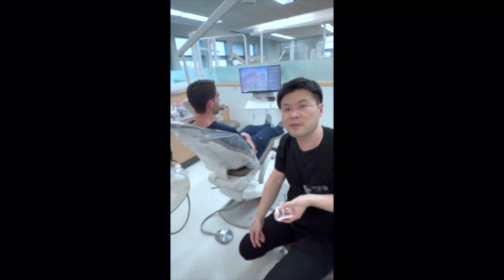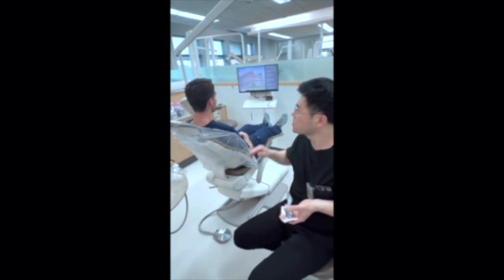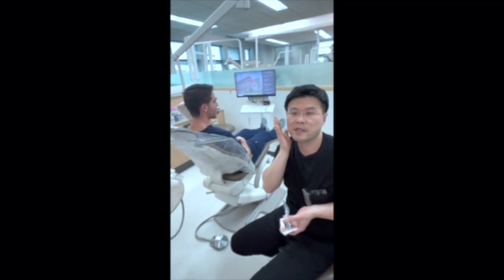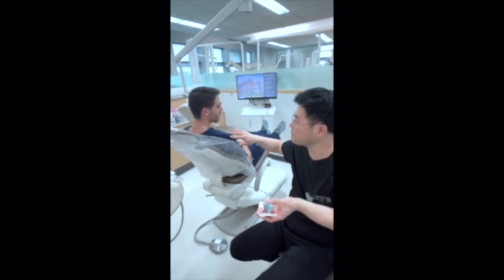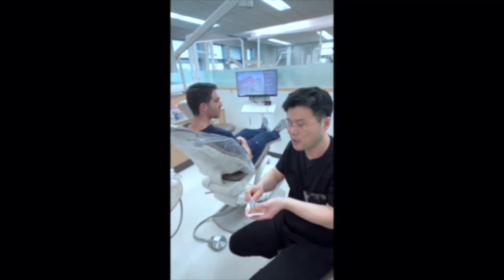It's difficult to relax in clinic and patients are stressed, but if you give them that affirmation and a soft pat, it can really help them relax. It's not 100%, but it is a very helpful technique. So when you're pushing down, just give them a soft tap on the shoulder and then gently push down.